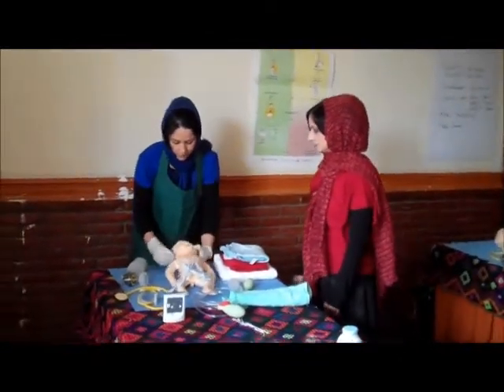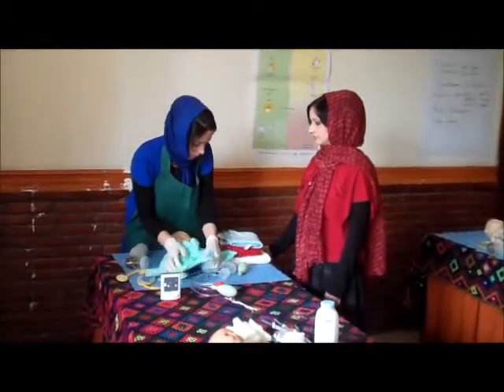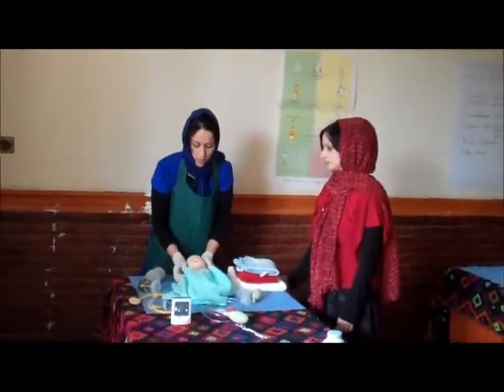First, we should cover the head and then cover all of the baby's body, including the foot and hand, except the chest.